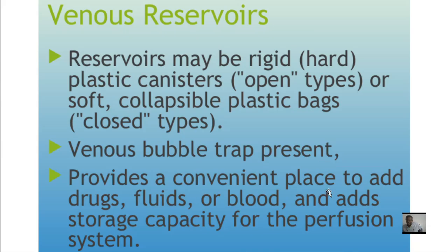The venous reservoir provides a convenient place to add drugs, fluids, or blood, and adds storage capacity for the perfusion system.